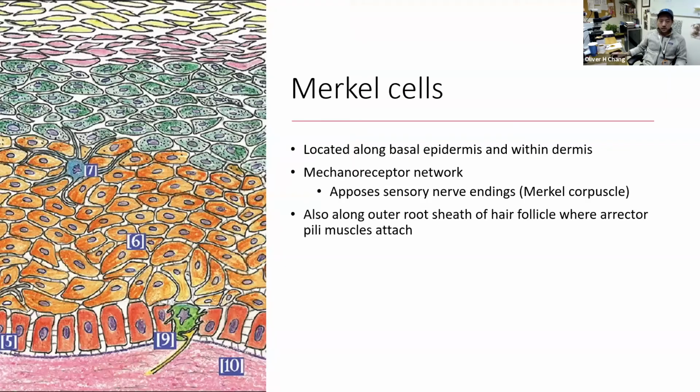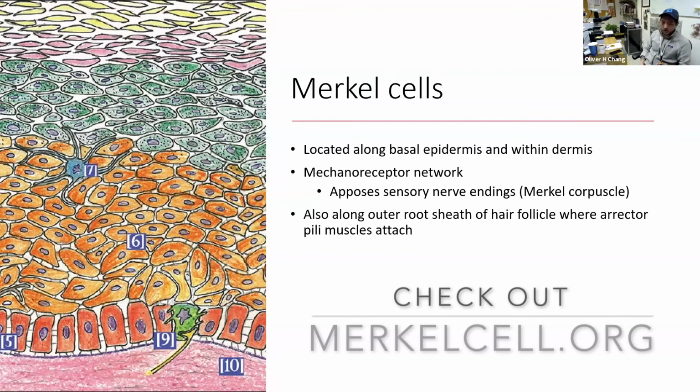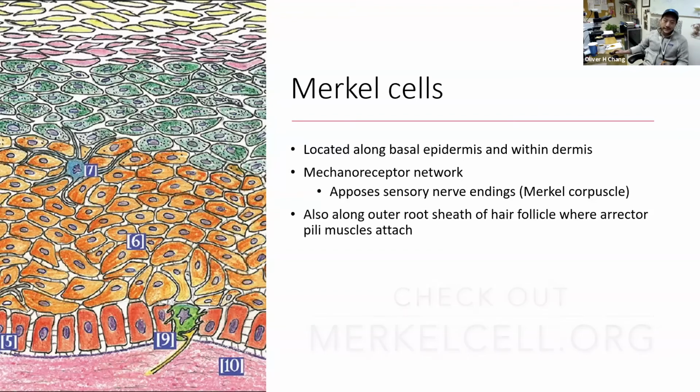Okay, Merkel cells. The only time we ever talk about Merkel cells is Merkel cell carcinoma. And it's not even known whether Merkel cell carcinoma is derived from Merkel cells or a precursor cell to Merkel cells. Merkel cells are located along the basal epidermis and in the dermis.